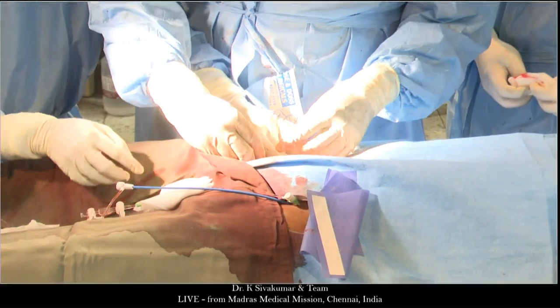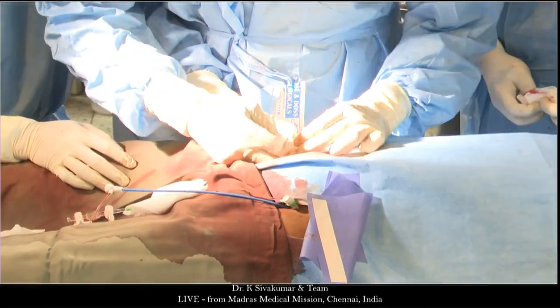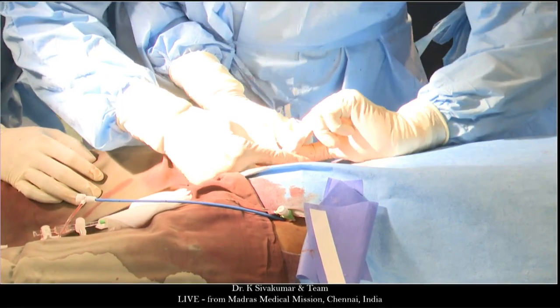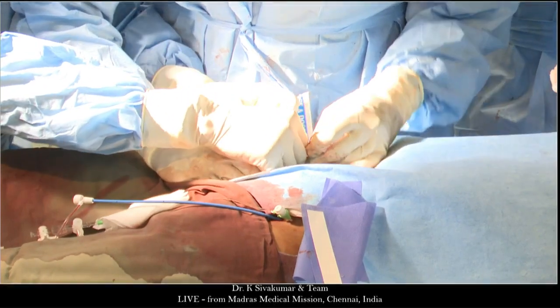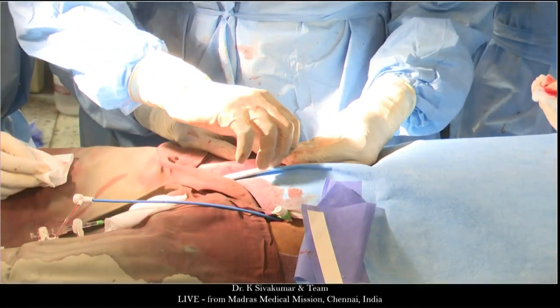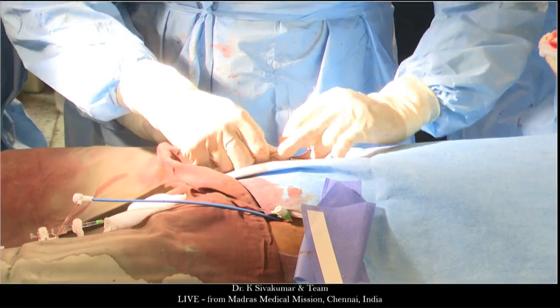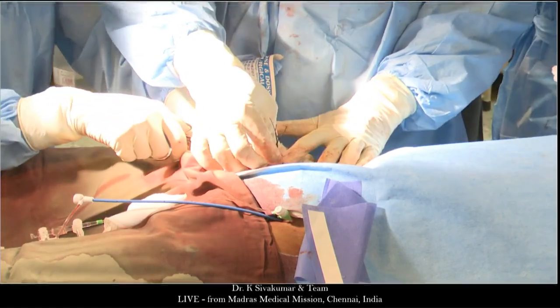In covered stent embolization, we have had it in 5 of our 135 patients. 3 of the patients happened after we removed the guide wire circuit. In these 3 patients, they went straight away for surgery. Whereas in 2 of the patients, it happened while the wire circuit was still present. That means I had a stiff wire running into the right jugular vein. In these patients, I put in an additional overlapping stent, and I was able to rescue the patient without sending them to the operating room.